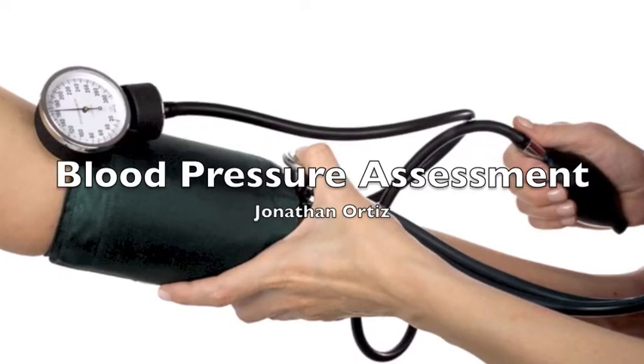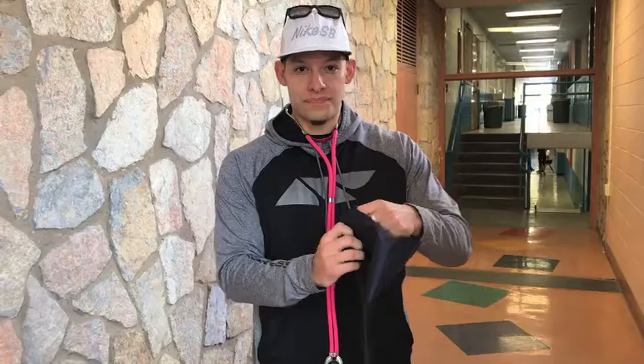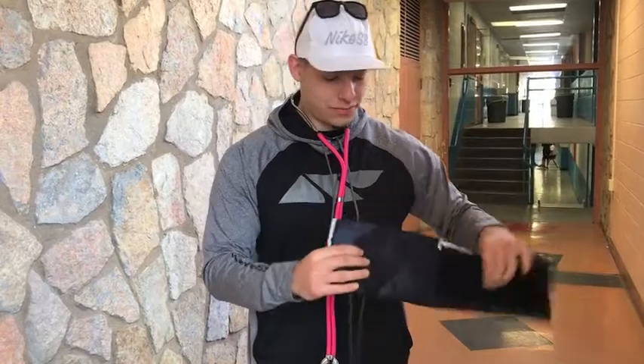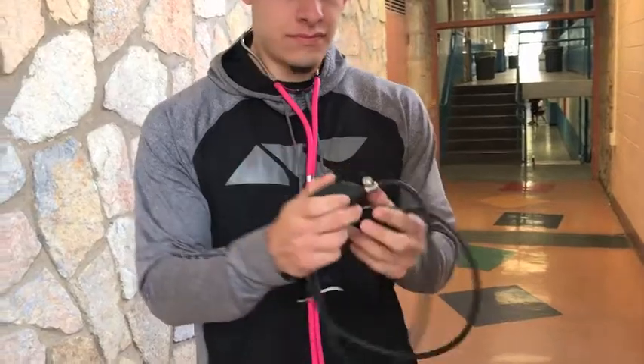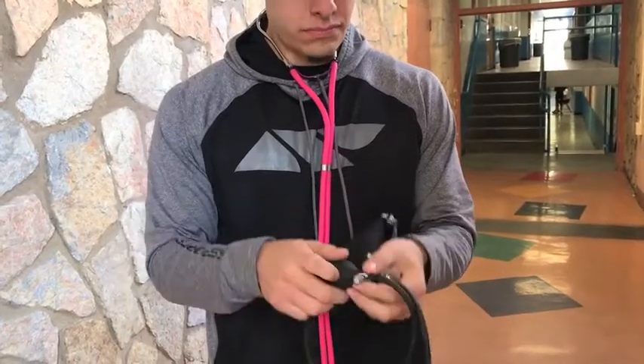Blood pressure assessment. Equipment needed for the assessment will be a blood pressure cuff, a hand bulb with the dial turned all the way to the right, a sphygmomanometer, and a stethoscope.